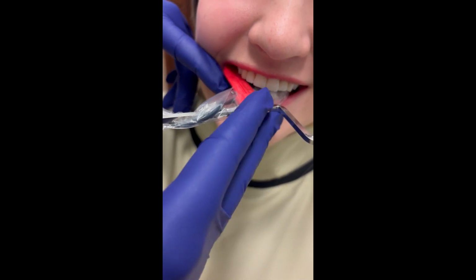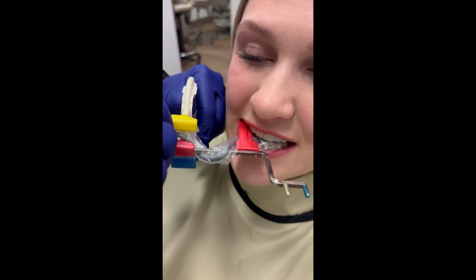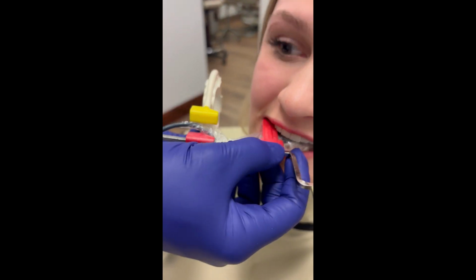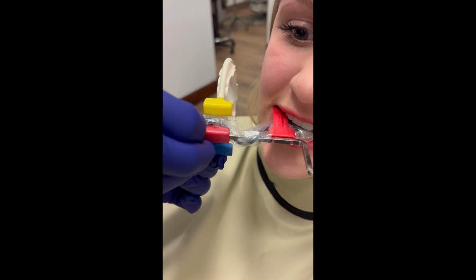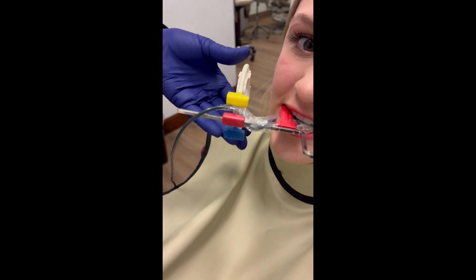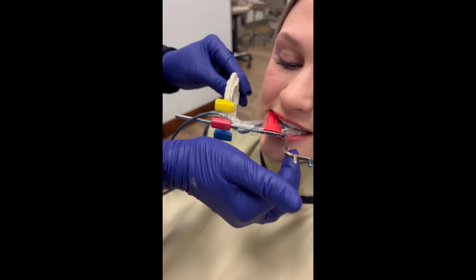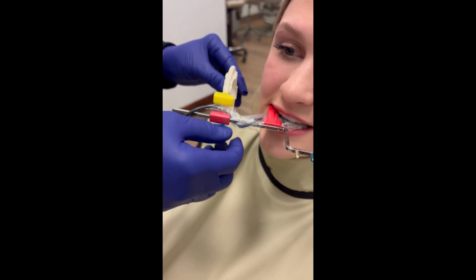And then I get my ring as close to the cheek as I can, because the closer the x-ray beam and the cone are to the sensor, the more clear the image will be. Now I'm going to try to do something also where my sensor and the teeth are parallel.